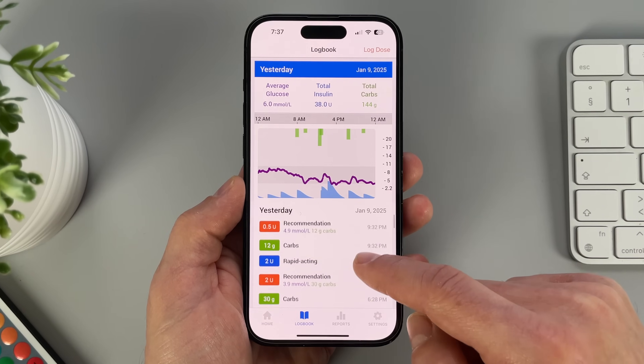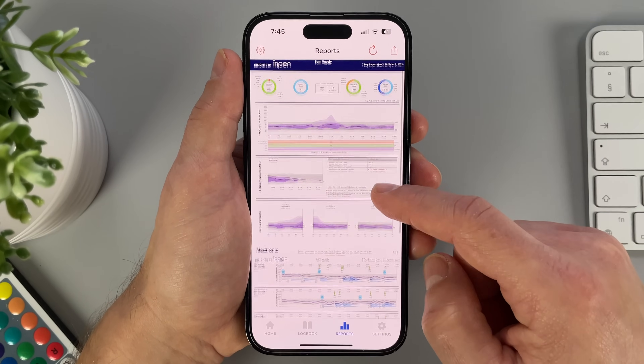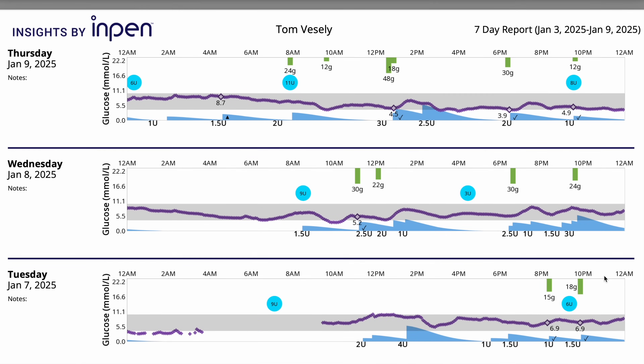Moving on to the next feature, which made my diabetes management on multiple daily injections a lot more effective. The InPen keeps track of my sugar levels, my rapid-acting insulin, my long-lasting insulin, and meals. The app can create reports that I can share with my endo — and when I saw these reports, I was impressed, because they are as good as the reports from my insulin pump. I hadn't realized this was possible with MDI. My endo really enjoys these reports too, because when he has a complete set of information he can come up with good suggestions, rather than receiving a chaotic handwritten notebook with half the information missing.